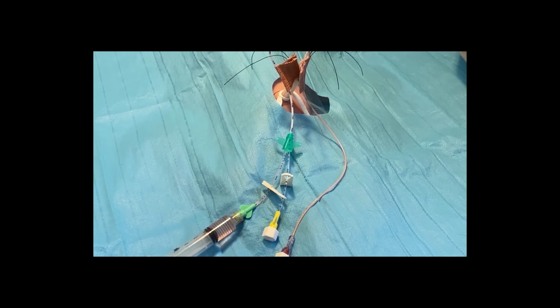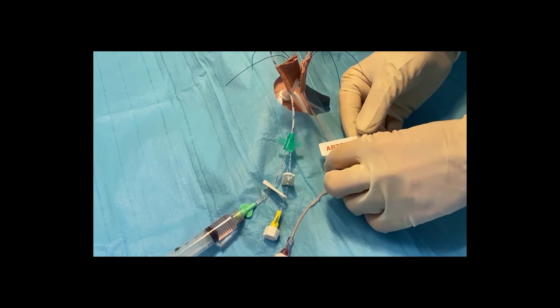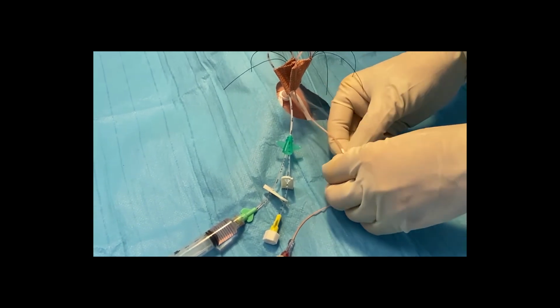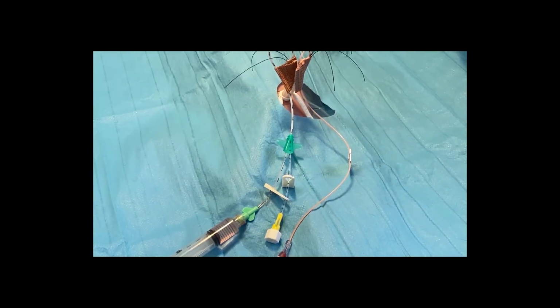Once the catheters are secured, you want to make sure that you add the arterial sticker to the arterial line so that there's no confusion between the 2 different catheters. Then you want to connect them to their infusions. To check the position of the lines, you need to order a chest and abdominal X-ray.